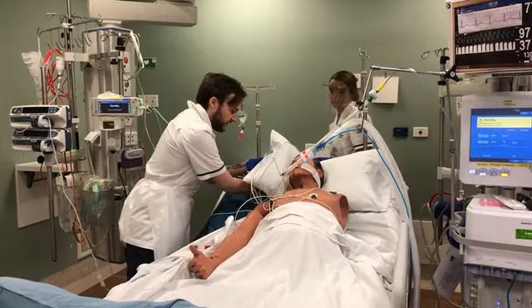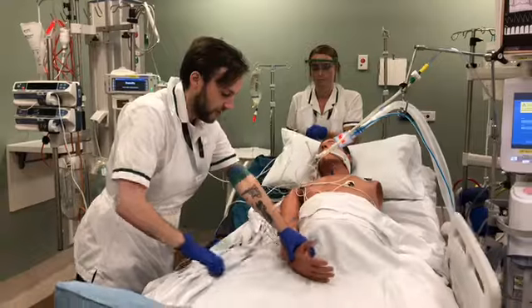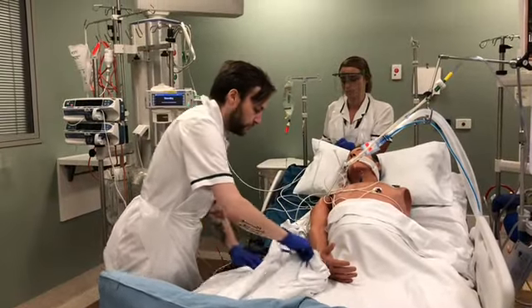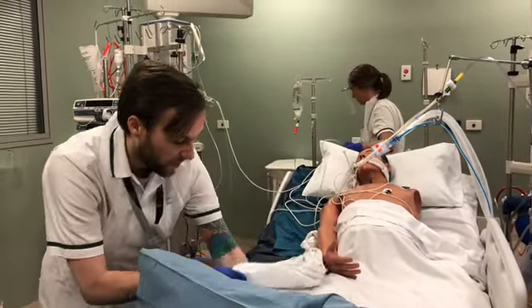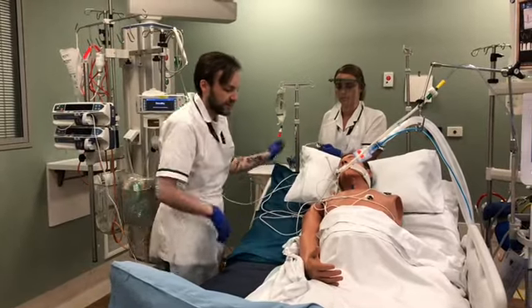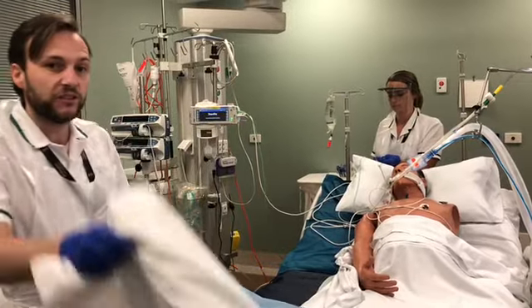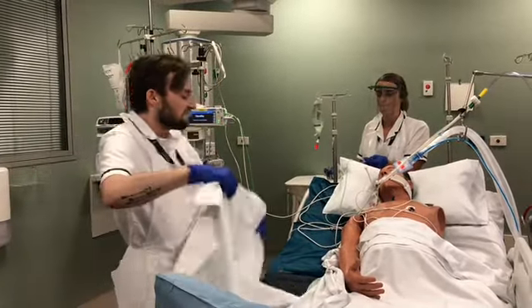While Kate's doing that, I will be at least getting a sheet ready on the side of our patient here so that when we do our turn, we will be able to do a simple turn and pulling our sheets out. While doing this, we will be leaving an X-ray slidey underneath our patient in case they do need a chest X-ray at any point during the next shift.